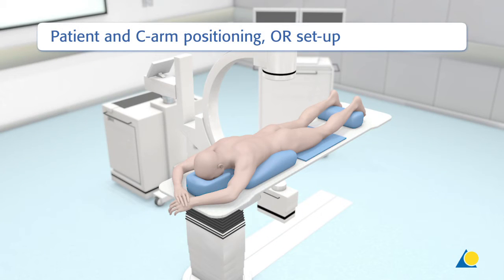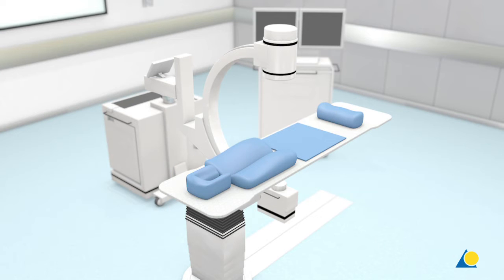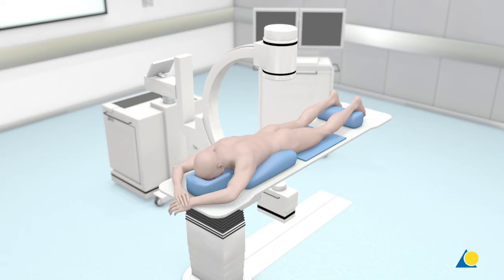Patient and C-arm positioning, OR setup. The patient is positioned on a radiolucent table in the prone position, with radiolucent bolsters to support the chest and abdomen, allowing the pelvis to slightly flex so as to decrease the normal lordosis.